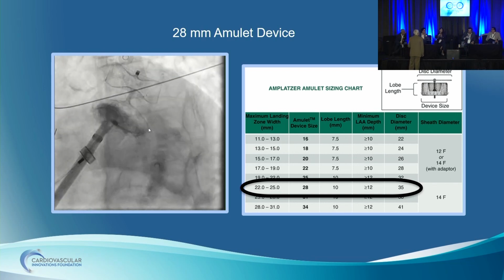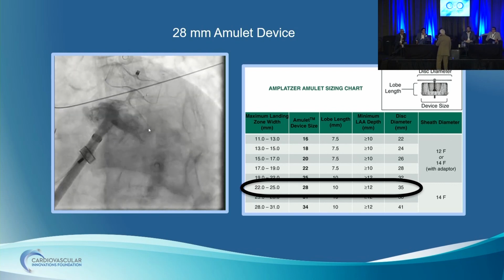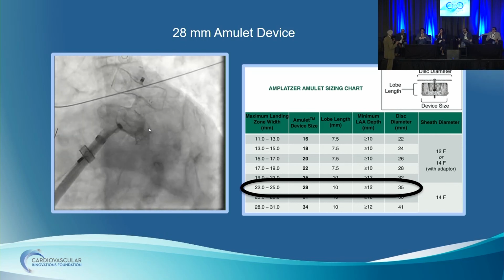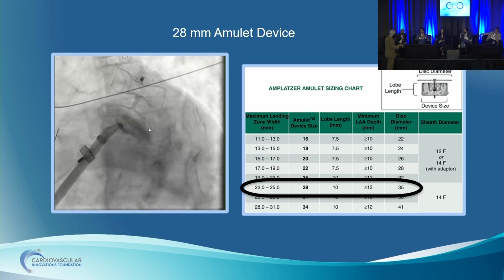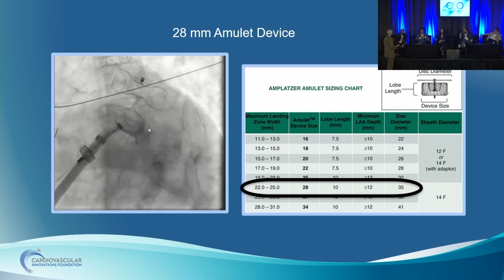Can I ask, I know the measurements were based on 2D, were there 3D measurements or CT measurements for comparison? This is one of the discussion points that we're going to talk about relative to this case. I have drifted over the past several years to doing less and less pre-procedural imaging. I have been guilty of doing very little pre-procedural imaging because we did a prospective study at our institution randomizing patients to no pre-procedural imaging versus pre-procedural imaging, and found that our success rates were really no different, and the number of cases we had to abort was really quite few. So I've been going in that direction, but I'm going to tell you, after all this, I've now gone back the other way.